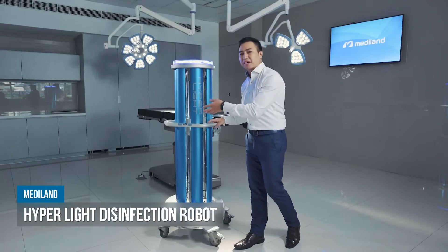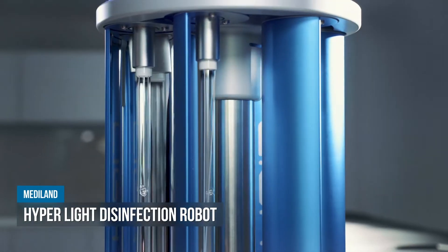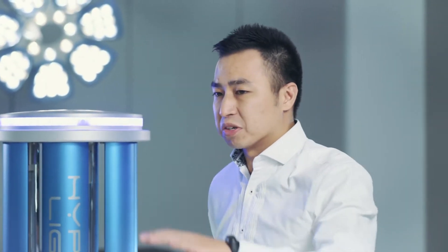I'm going to introduce the Hyper Light disinfection robot. This device can generate 254nm UVC to kill all potential threats like pathogens, microbes, bacteria, and viruses from the surface.